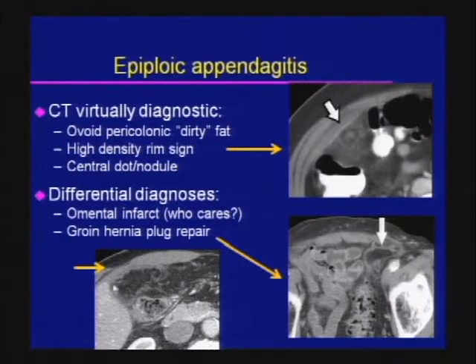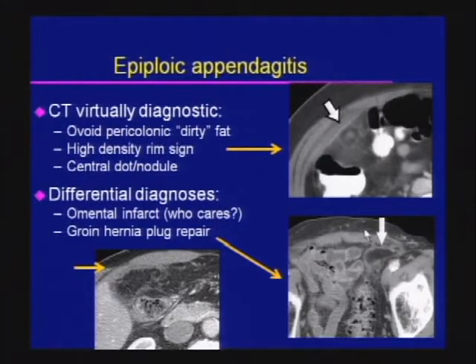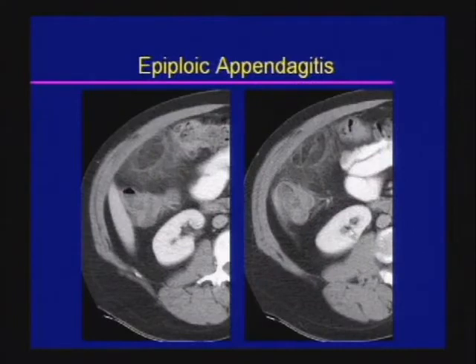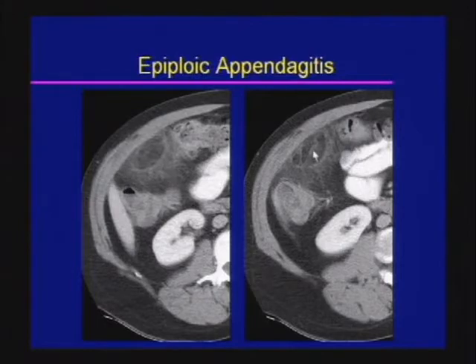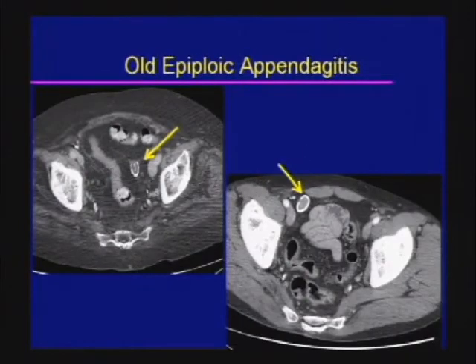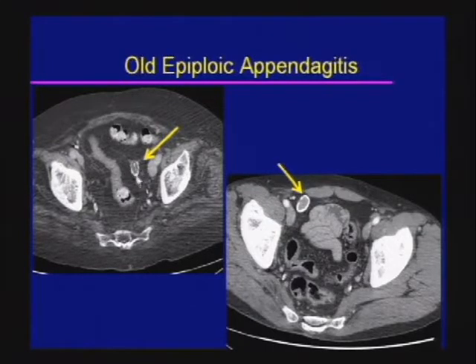Here is an example of an omental infarct, and in another case, this is actually a hernia plug done at the time of left inguinal hernia repair. Additional cases show the same findings: hyperdense rim, fatty focus, pericolonic stranding, and a central dot sign. When epiploic appendagitis heals, it can scar down, become calcified, and leave just a small nub of soft tissue in the region of prior inflammation.